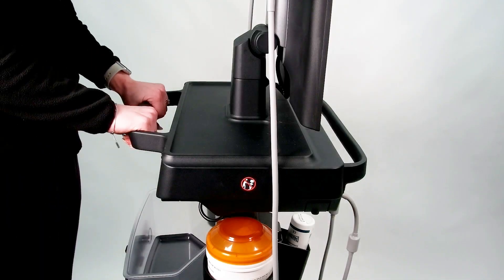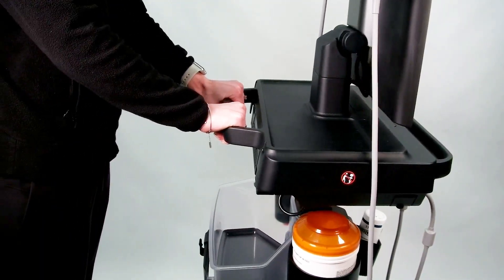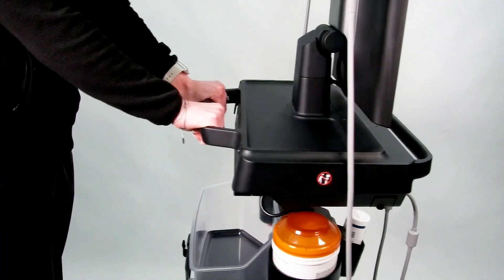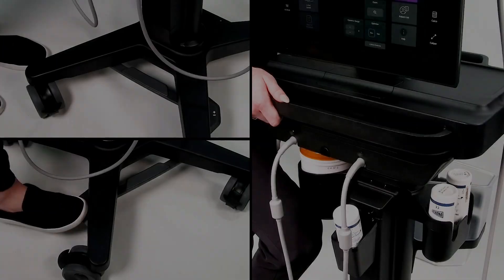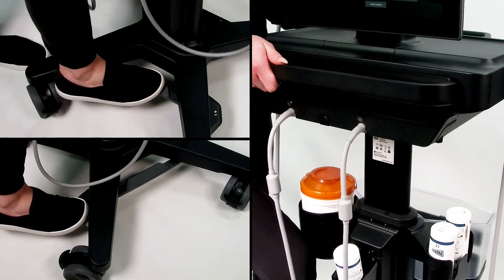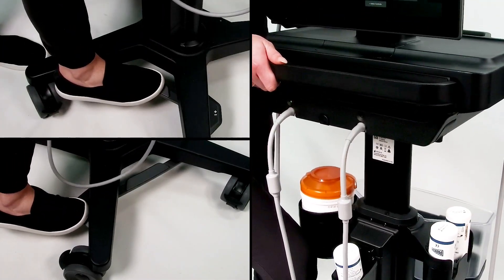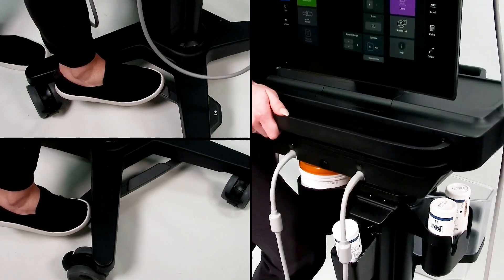You can move the system by pushing or pulling the handle on the back or front of the system. Adjust the height by stepping on the front or side of the foot pedal and pulling up or pushing down on the platform.